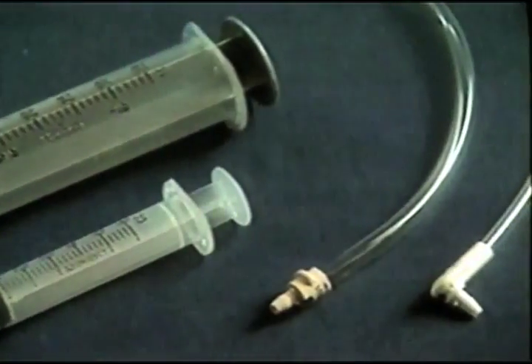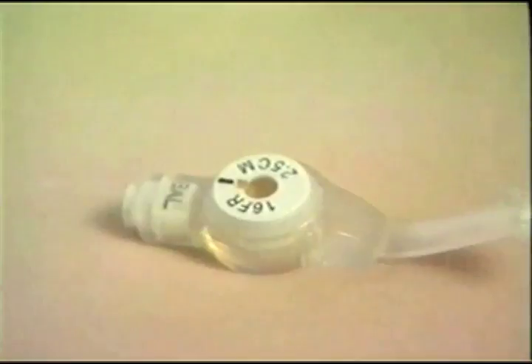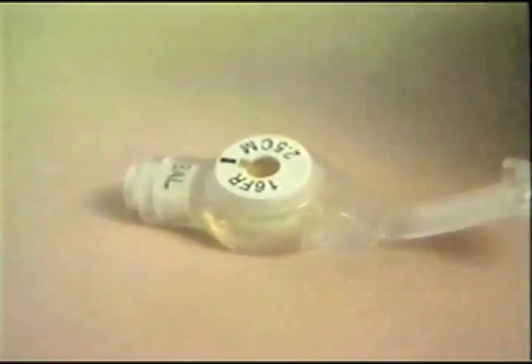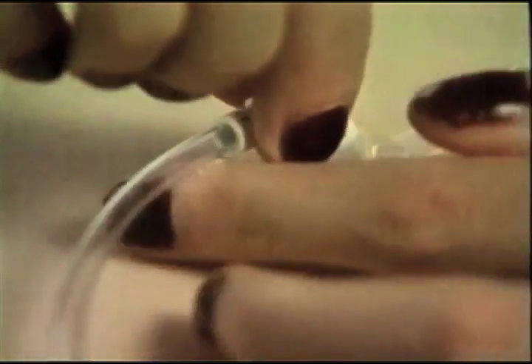Just follow these steps. Using the appropriate extension set as your doctor has directed, connect the extension set to the Mickey feeding port. Align the black line on the extension set connector with the line on the feeding port. Push it into the anti-reflux valve and turn it clockwise. To disconnect after feeding, realign the black lines and pull out the extension set connector.